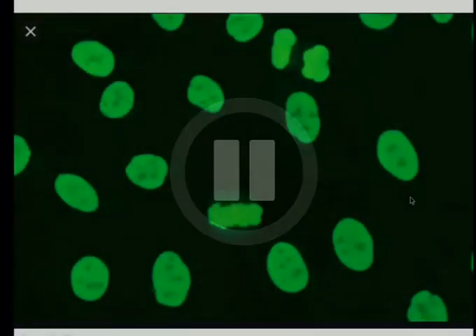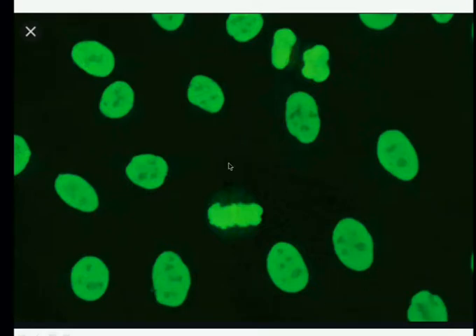There are various patterns of antibody. These are what's seen in indirect immunofluorescence. This pattern is called the diffuse homogeneous pattern, or homogeneous or diffuse nuclear pattern.